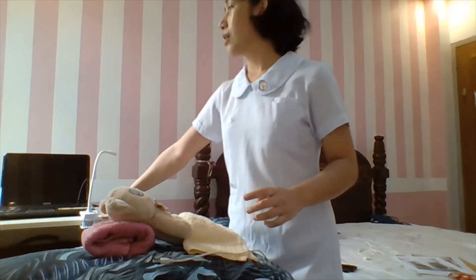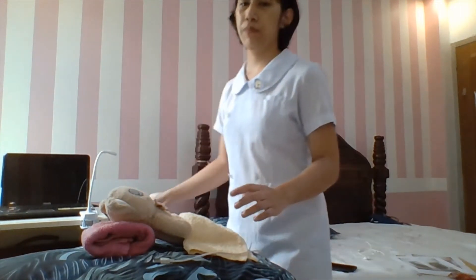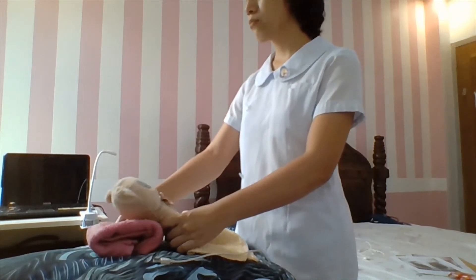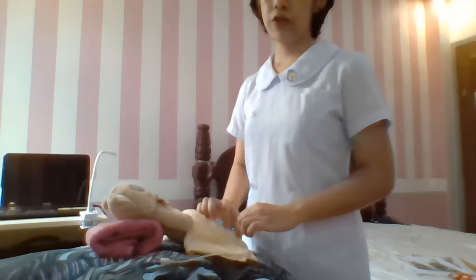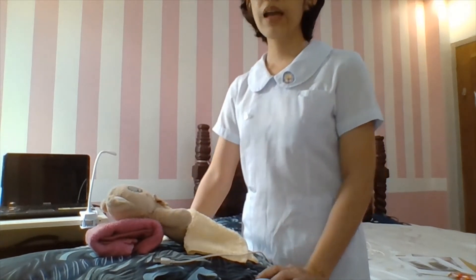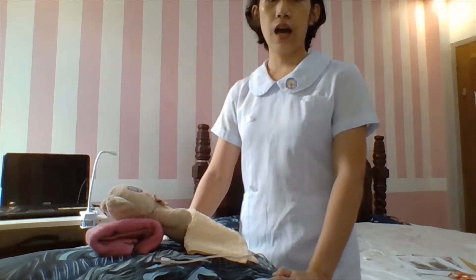Place the ECG machine at the patient's bedside to save time and effort. Adjust the level of the bed to a comfortable working position. The ECG machine must also be plugged in. Position the patient comfortably to prevent tension, expose the patient's arms and legs for placement of limb electrodes, and encourage the patient to relax as this procedure will take about five minutes at most.